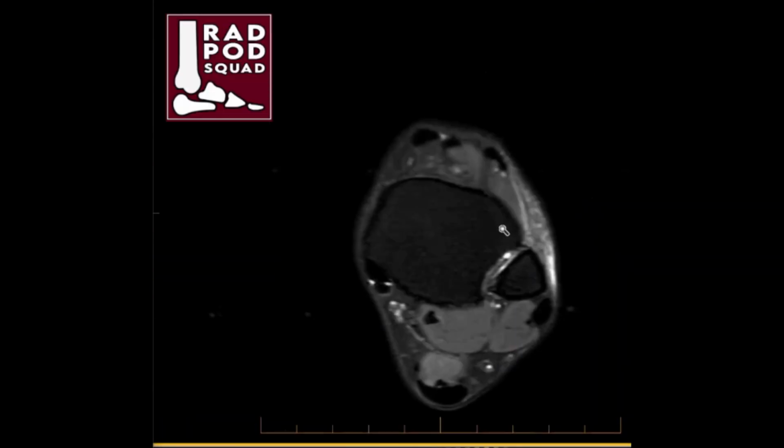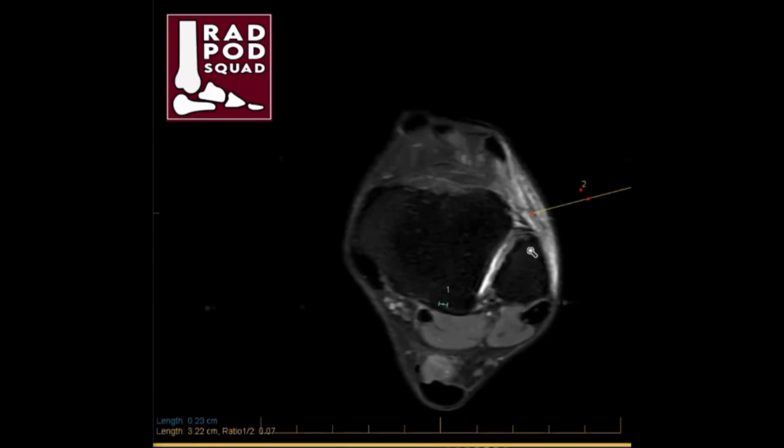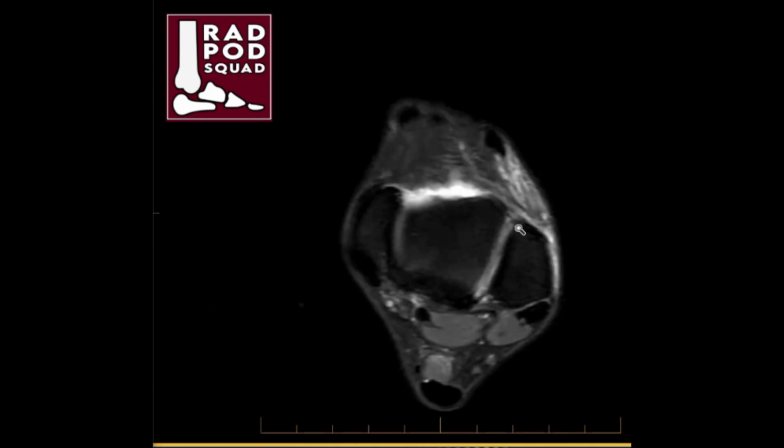While we start up high along the syndesmosis, we begin to see that the layers of the anterior-inferior syndesmosis actually have some type of edema between them, but they're still intact and I can still see them in this way, and I can see the lowermost fibers.